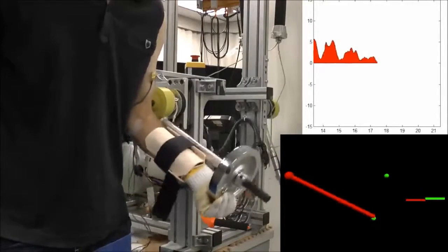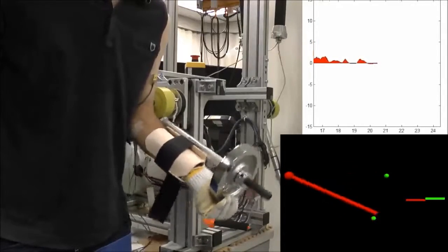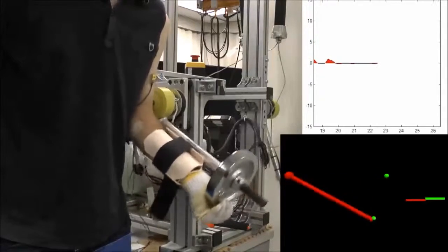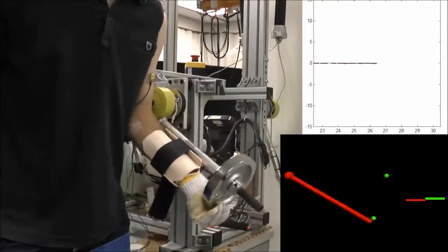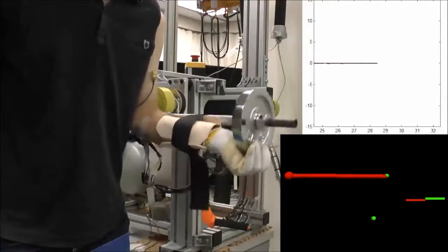In the first scenario, we examined a situation where an able-bodied subject is using an elbow exoskeleton. At the beginning of the first stage, the subject himself had to perform the desired motion.